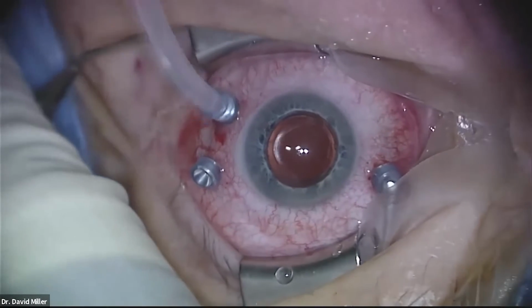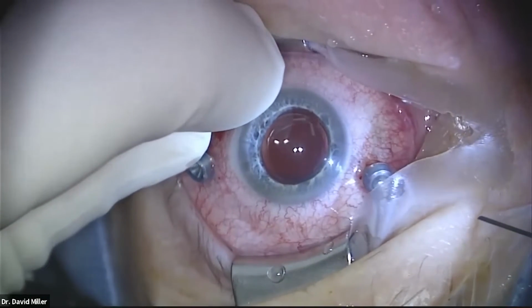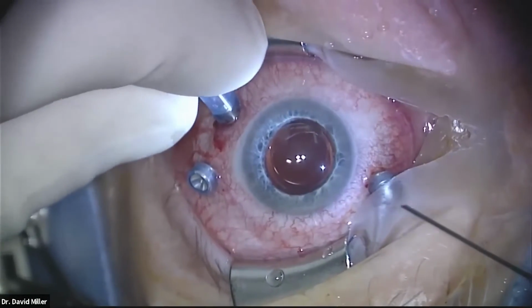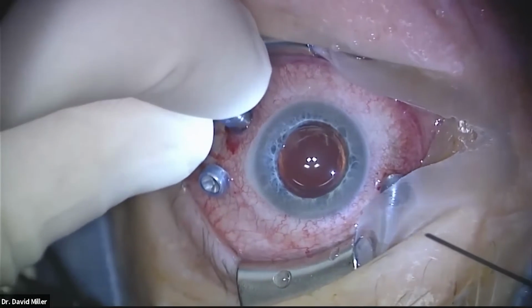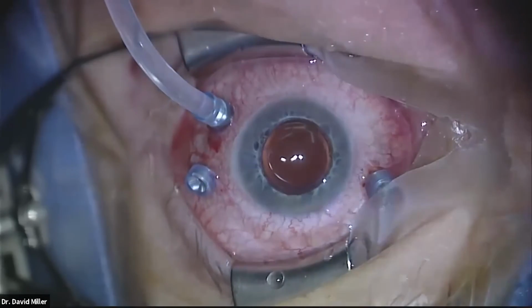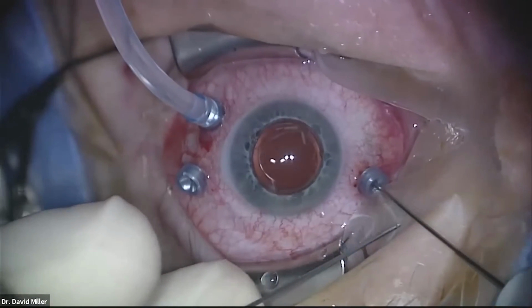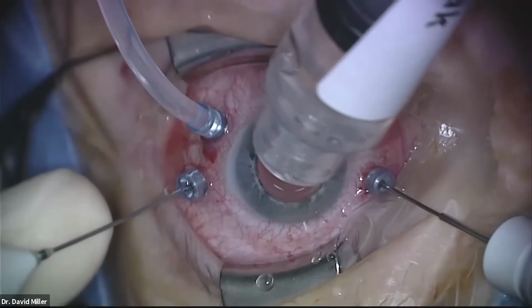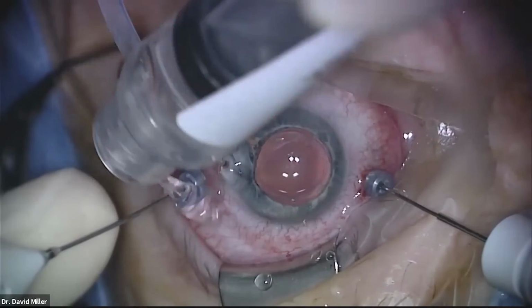And then we're going to take a quick look to make sure, by looking off to the side and pressing that in, that I can see it in the eye, and I can. I doubt that's visible on the microscope. But when you look outside the microscope, looking around to the side, I can see that quite well by pushing it in. Again, always start the vitrectomy on the temporal side. We'll put a little Gonak on the eye to keep the cornea lubricated and drop in the wide field visualization system.